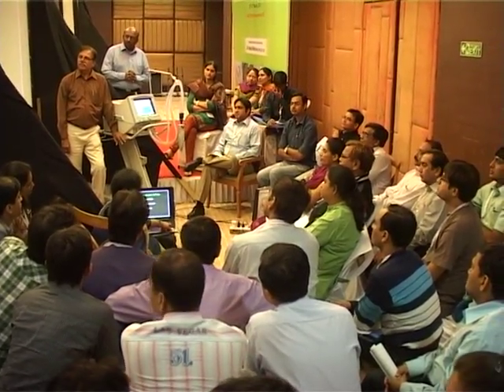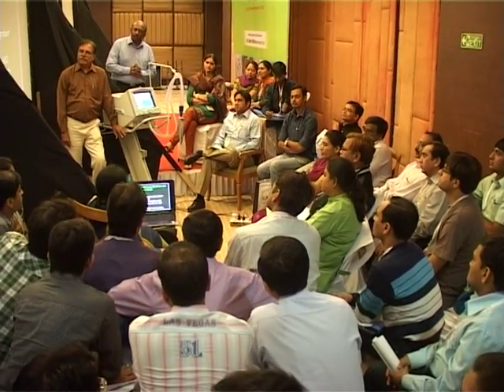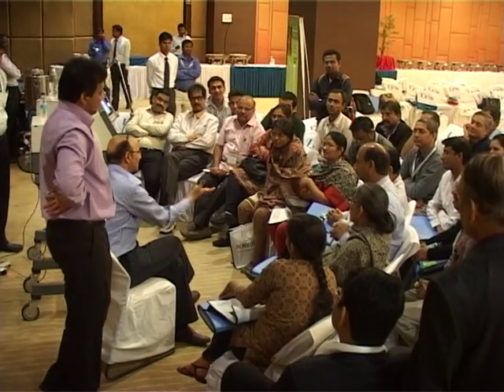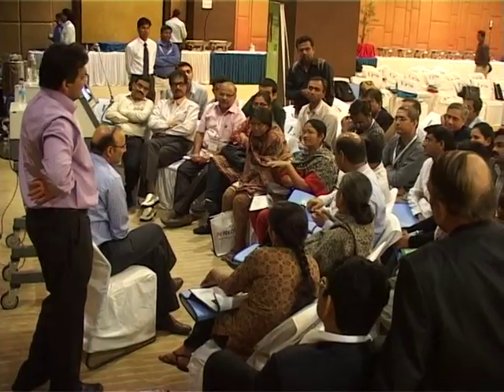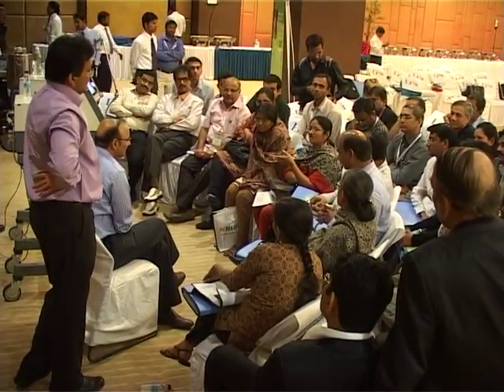Central alarms. So in this, what are the alarms on the machine itself? Yes, time trigger, a time-based signal. So whatever the volume is fixed, the machine will deliver that volume, with the pressure being variable.